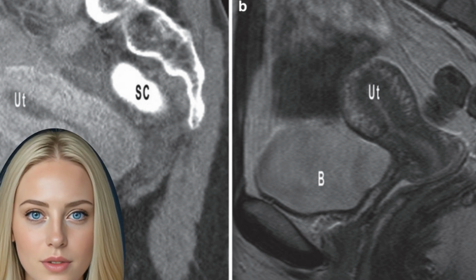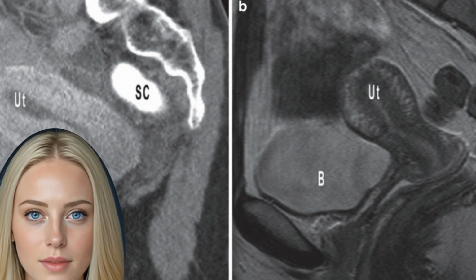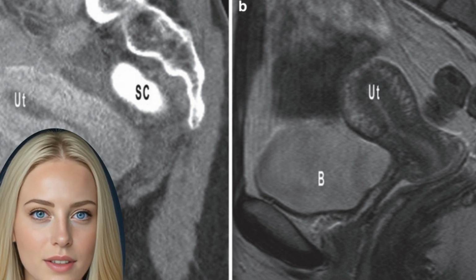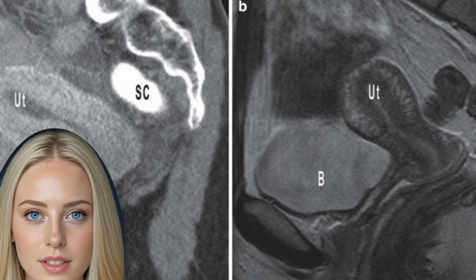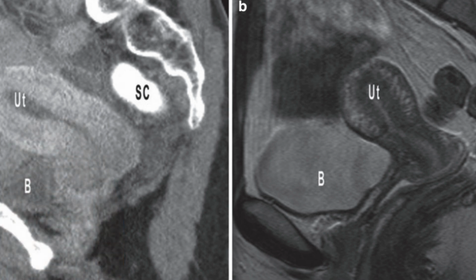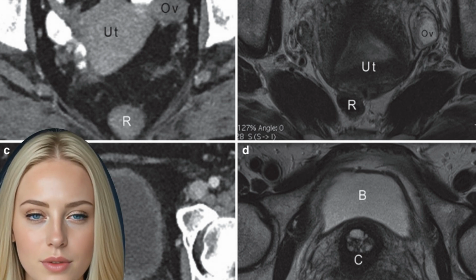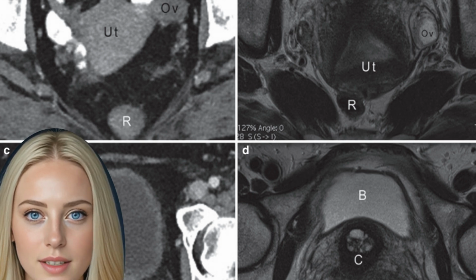Native high-resolution T2 weighted images, T2WI, are essential for morphological differentiation of pelvic organ tissue. Contrast-enhanced T1 weighted images, T1WI, give important additional information in almost every problem and should therefore be routinely performed. However, kidney function, creatinine, should be checked before the intravenous application of contrast media. As the intravenous MR contrast agent is gadolinium, Gd, based, thyroid function is not required to be checked.